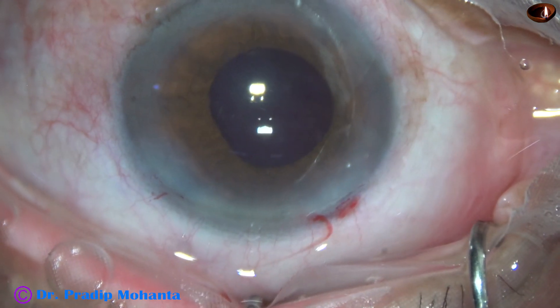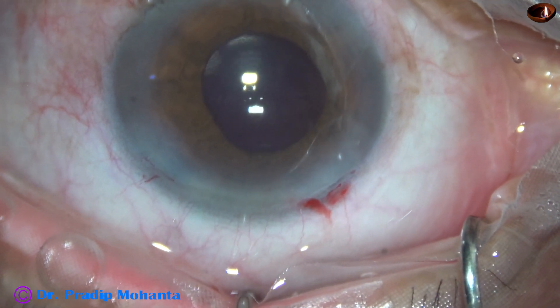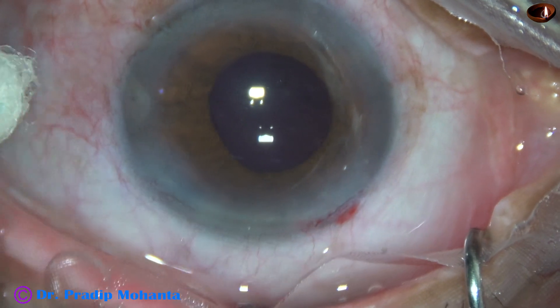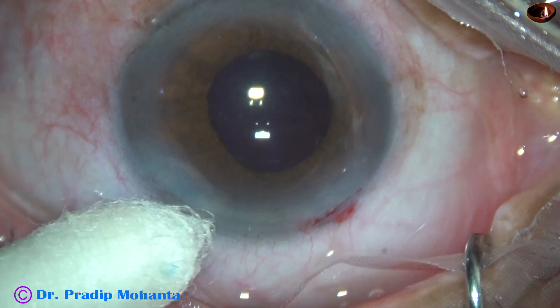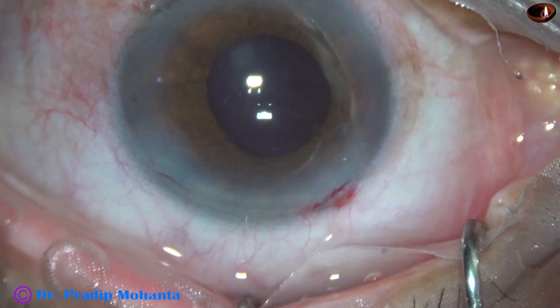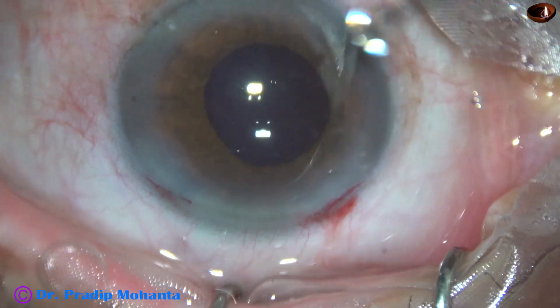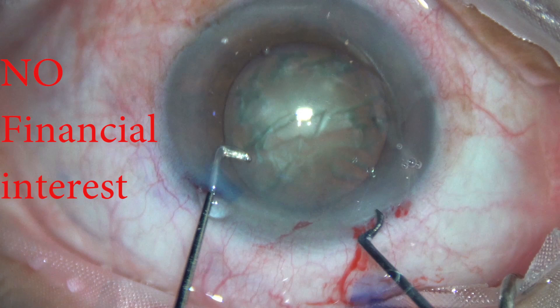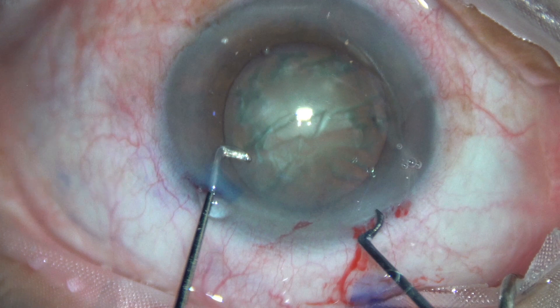There are a lot of problems in such cases — high chance of catching the iris with the phaco probe and many other complications. Here we conclude the case after forming the anterior chamber and checking the integrity of the wound. I hope this video encourages you to use the pre-chopper in cases of IFIS. But you must use this pre-chopper first in routine cases with well-dilated pupils, then only will you be able to use this instrument confidently in these difficult cases. Thank you very much for your attention.